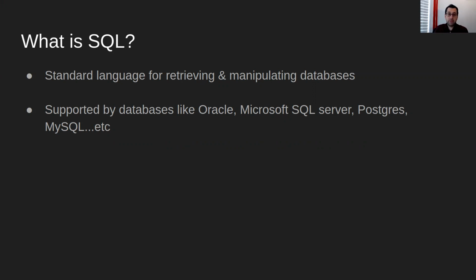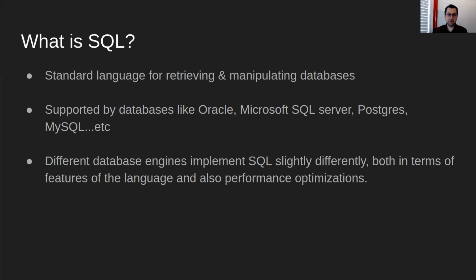All the big database vendors out there, like Oracle, Microsoft, and the open source ones like Postgres and MySQL, they all support it. There are many other database flavors that also support SQL. It's a very well implemented standard, again, with some nuances. As I said, some of them will have slightly different dialects of SQL, but at the end of the day, there's something called ANSI SQL, which is the global standard. That's the core set of the standard that's supported by everybody. And then there are the variations of the dialects.